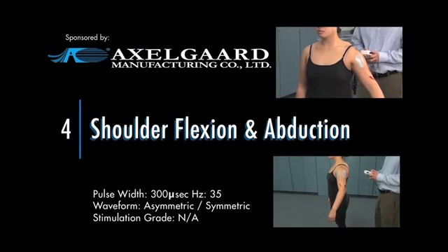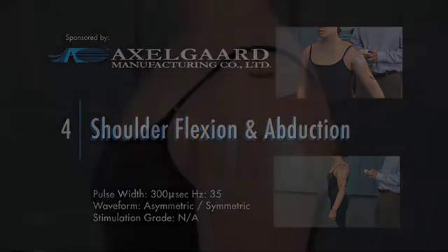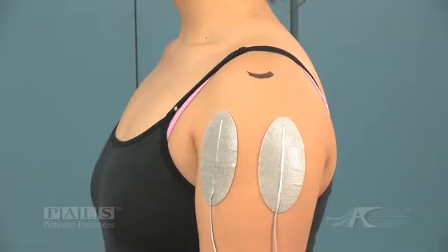Shoulder flexion and abduction. Electrode placements for shoulder flexion and abduction can be seen here, with one electrode over the anterior deltoid and the other over the middle deltoid. The acromion is marked with the marker.